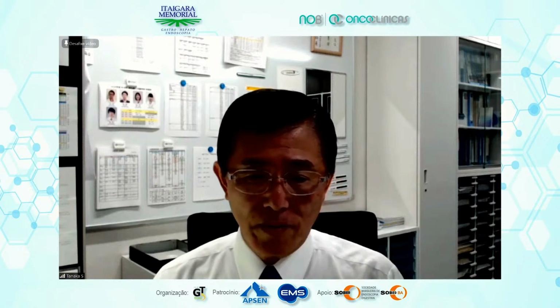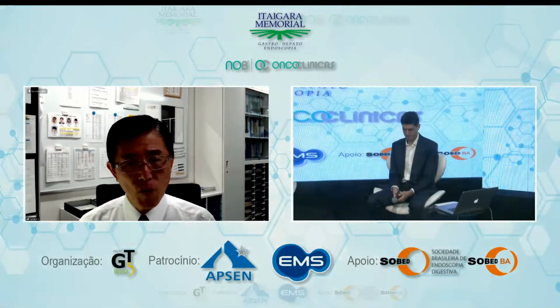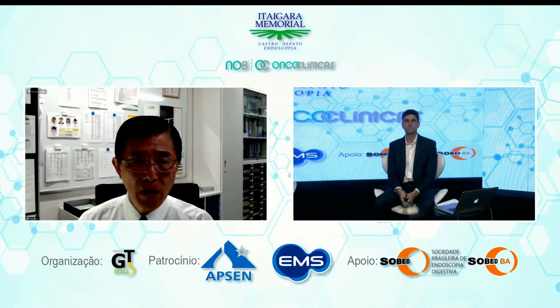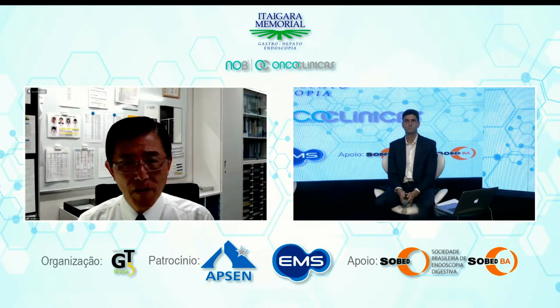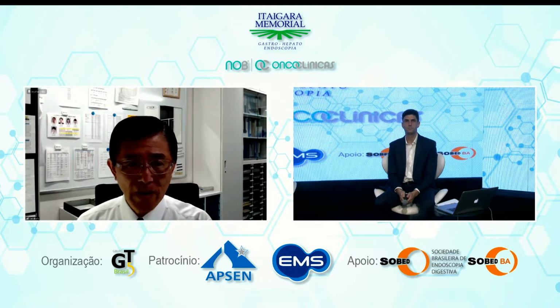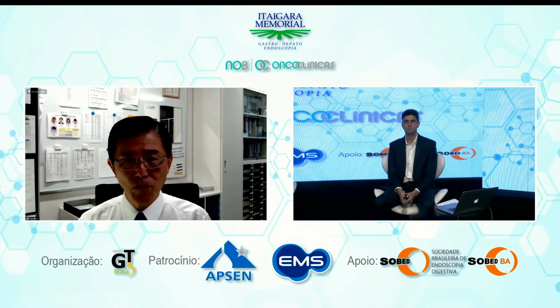Soon, in Japan, and maybe all over the world, Olympus will release a new version of its endoscopy system, the successor to Lucera Elite. This system has an almost autofocus magnifying function. So in addition to the launch of this new modality, NBI and pit pattern magnification will spread all over the world.